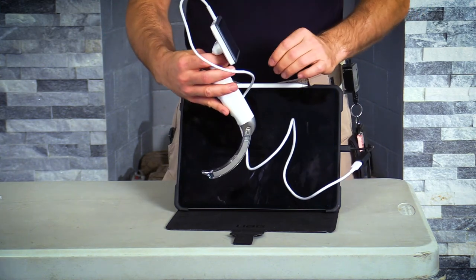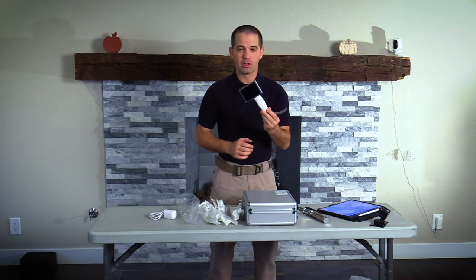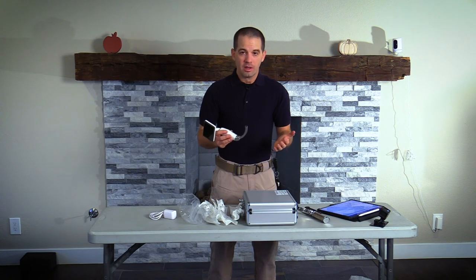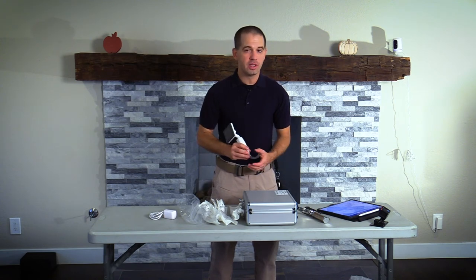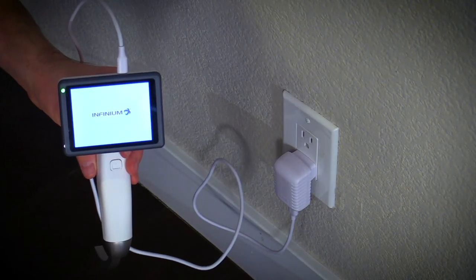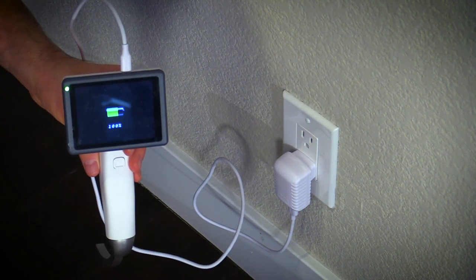There are some downsides to video laryngoscopy. The first and most prevalent issue is price — the Clearview is much more expensive than a manual laryngoscope. The second issue is the batteries. It uses a rechargeable battery with a shelf life of about 5 months according to the manufacturer. If you forget to charge it every 5 months or after heavy usage, you may not be able to use it. My initial thought was that it would still work connected to a wall outlet or USB battery charger, but this is not the case — the device just shows charging and continues to charge.